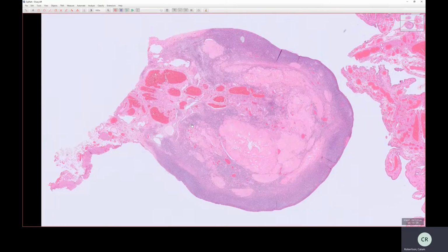The ovary has two main different parts to it. There's the ovarian cortex, which is this peripheral part, which has a blue appearance with pink stuff in it. And then there is the ovarian hilum, which is very highly vascular. It's full of blood vessels and connective tissue, and there's not really much to say about the ovarian hilum other than that. It's the cortex where everything happens.